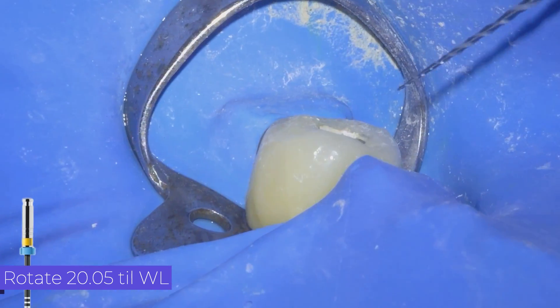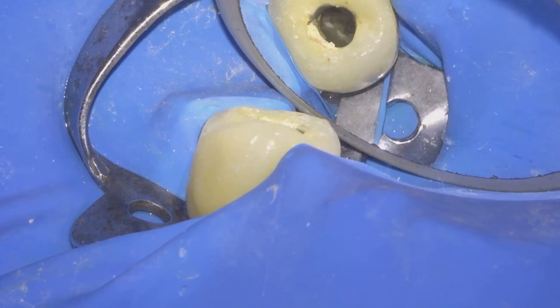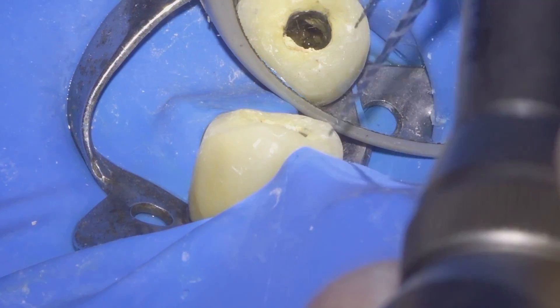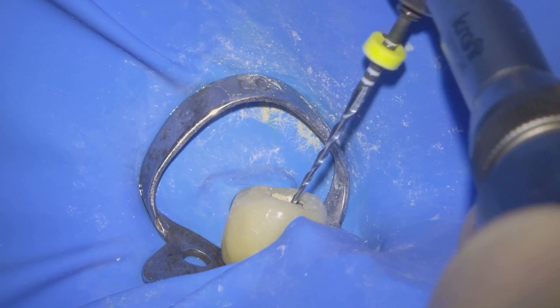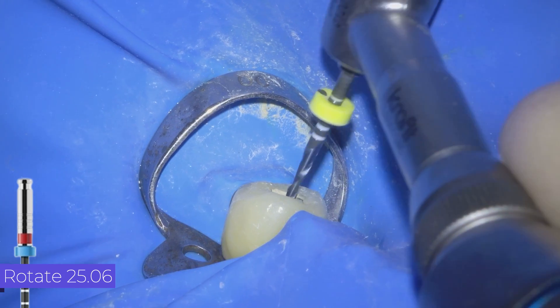If we notice a lot of pressure on the file and it is difficult to reach the working length, we irrigate and work again with the previous file. We finish the sequence with the 25 file at 6% taper.